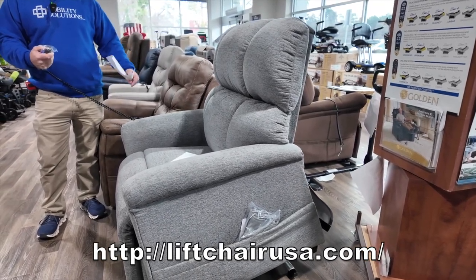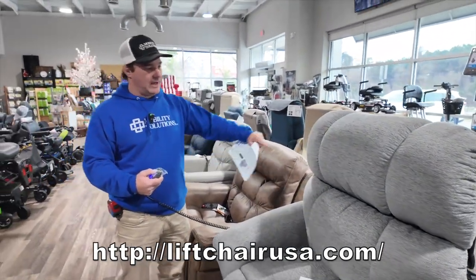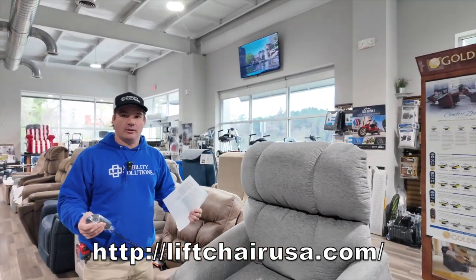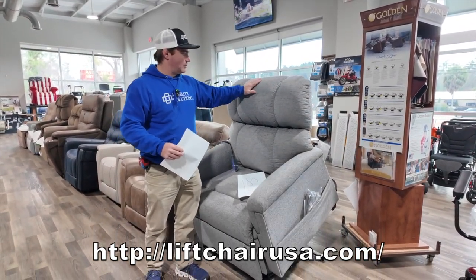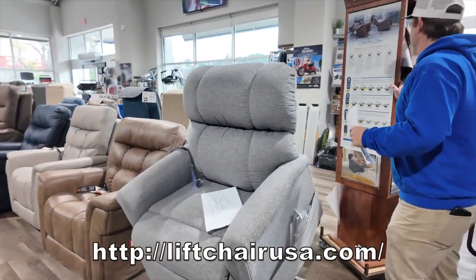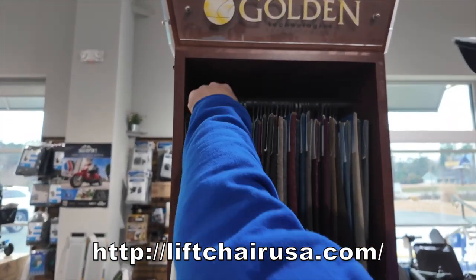You can get this chair in a lot of different fabrics. You can customize it with heat and vibration. They have about five different colors in this line, which they consider the in-stock or quick-ship chair. If you get this, you'll see on our webpage all the different fabrics. You can go with a Breeza fabric, like a cream if you want.